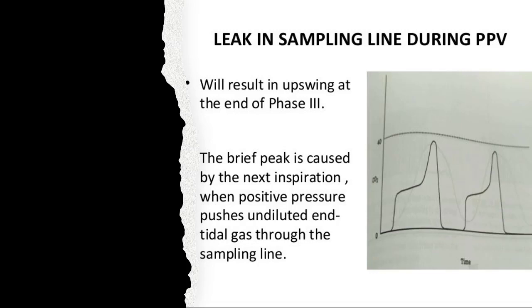Let me get to my pen. Normally what you'd expect with this is it would drop down and return to baseline. What they're saying here is that there's some CO2 trapped with dead airspace, and suddenly you have an increase as it's being pushed back. So I've never personally seen this, but this is a specific waveform that's mentioned in the literature, and it might mean that your end-tidal CO2 is not screwed in correctly, something like that. Again, anything abnormal, as a good practice, do your DOPE check really quick and then troubleshoot the obscure zebra stuff.